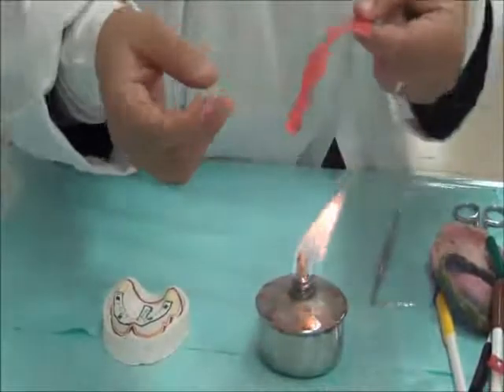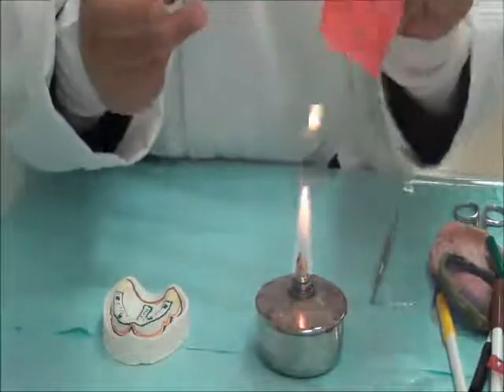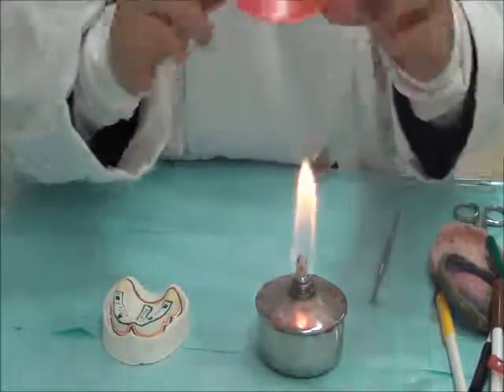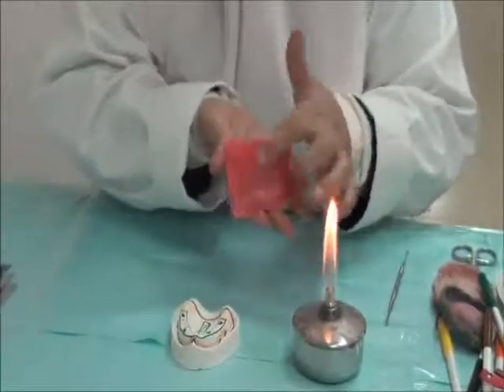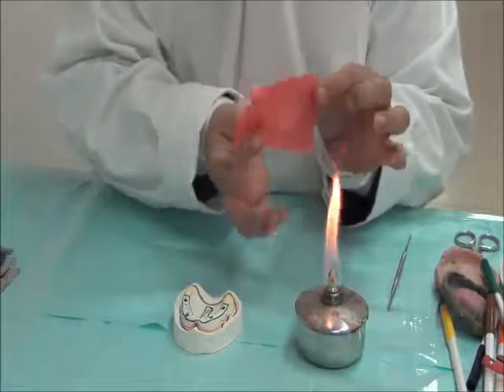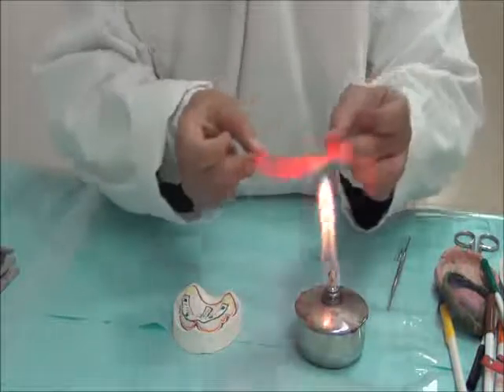We heat the piece of base plate wax until it is soft enough that it doesn't hold its weight. You can see that it's flowing, and I'm also heating it from multiple sides. This is called tempering, which is slowly heating the material. I don't allow the surface to drip. It becomes a bit light in color and pinky. So you go in and out, in and out.